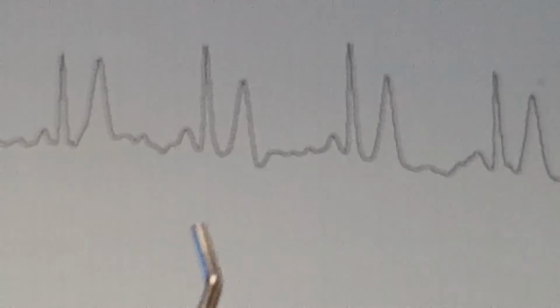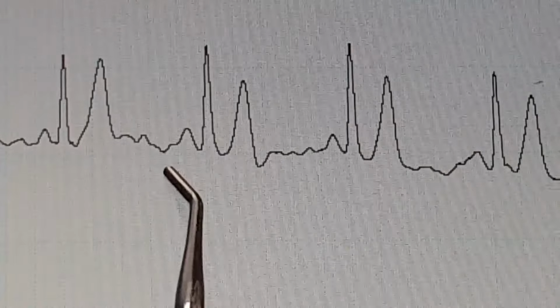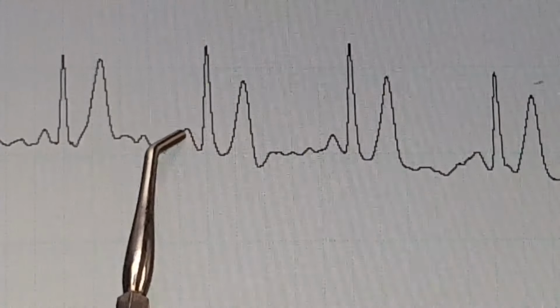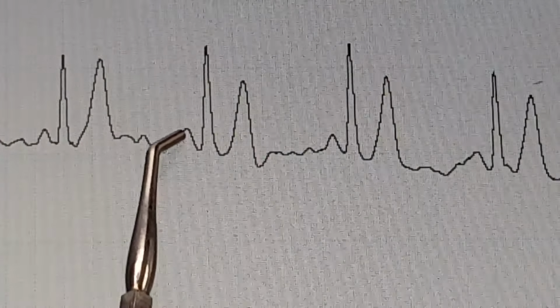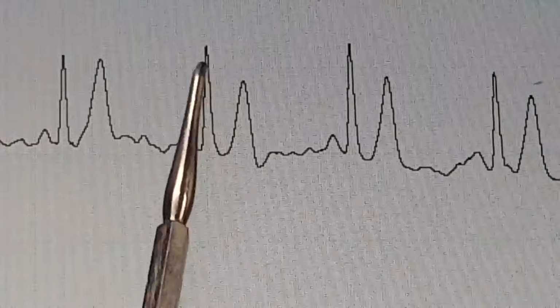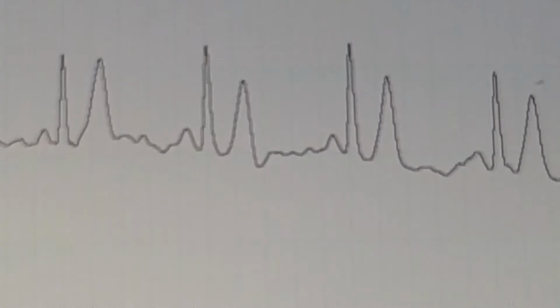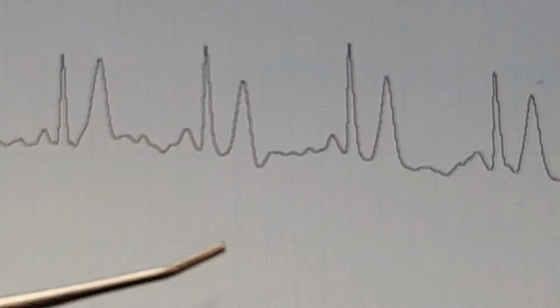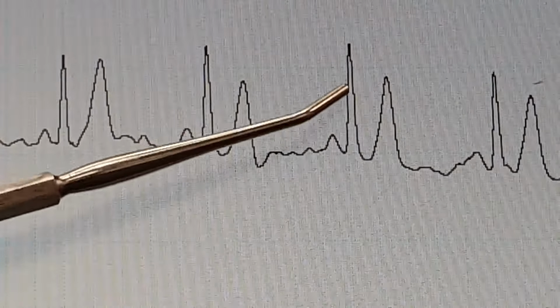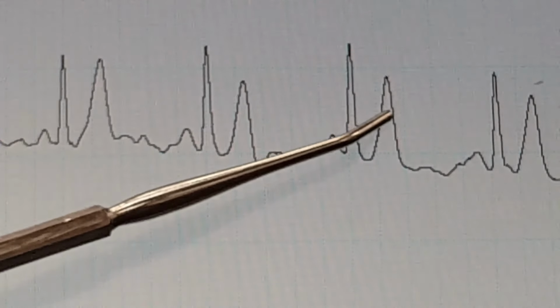So let's look, you and I, at this one right here. Follow along with me and the diagram that's in your lab manual. I can see right here the P wave. This tall spike, very narrow, is the QRS complex, and this hill right here is called the T wave. I can see the same thing in the next waveform over. Everybody look, P wave right there, QRS wave or QRS complex right there, and T wave right there.